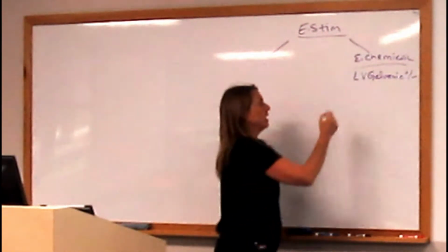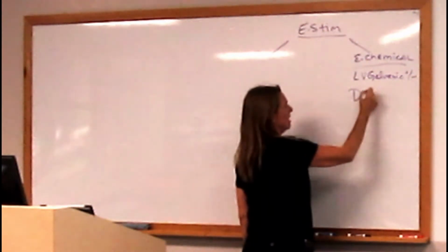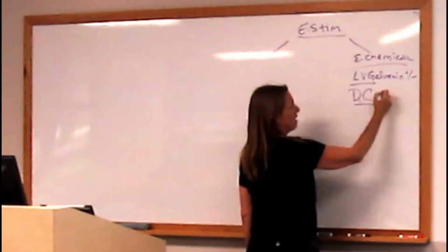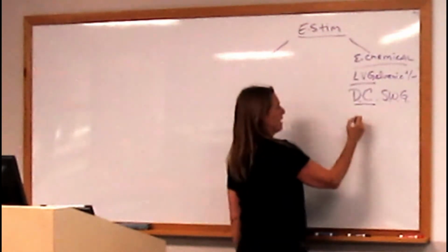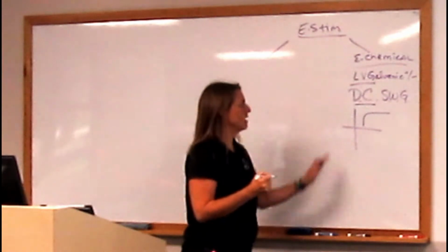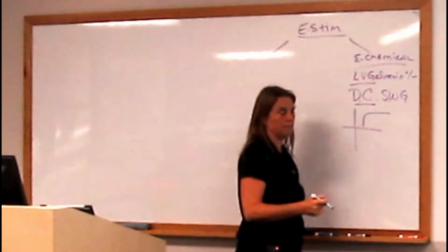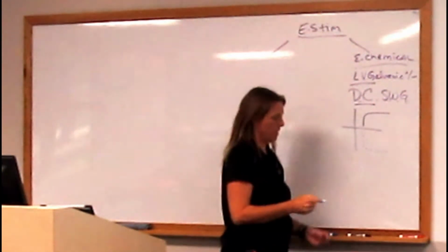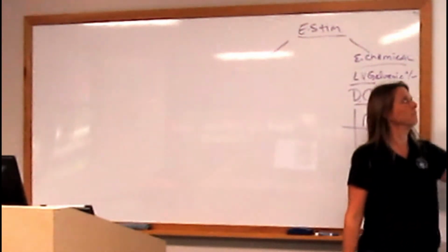When you're looking at low volt galvanic, the other names it could be is DC, or it could be called a smooth wave galvanic. The reason is because the waveform looks like this, where it's all above the x-axis. In this case this is a positive treatment, and if it were down here, it would be a negative treatment. And as you can see right here on the Chattanooga, you're going to push the DC button.